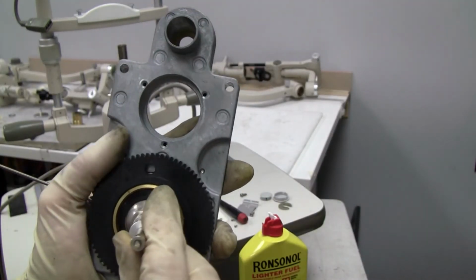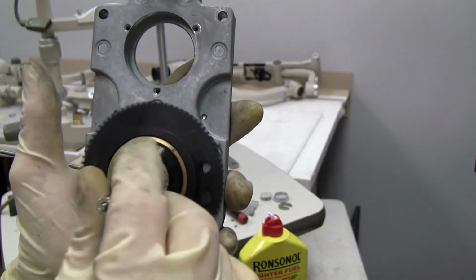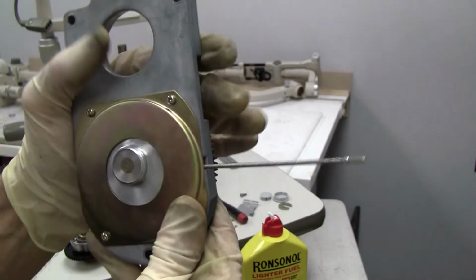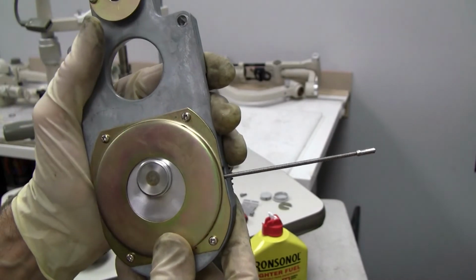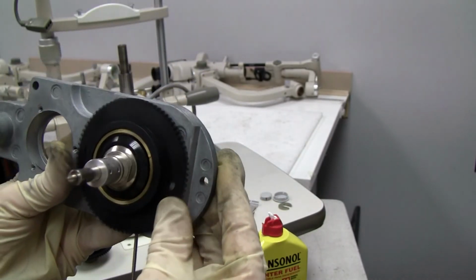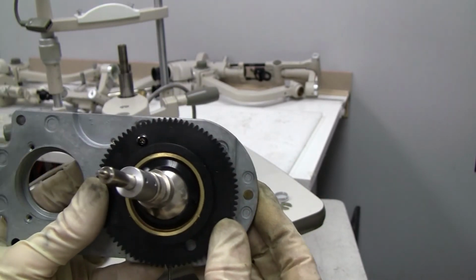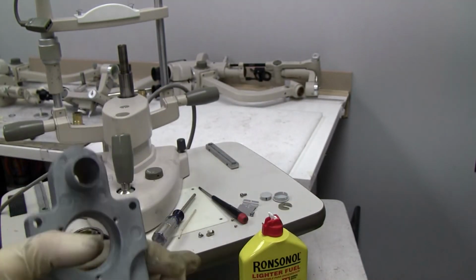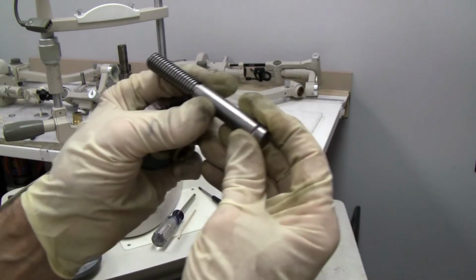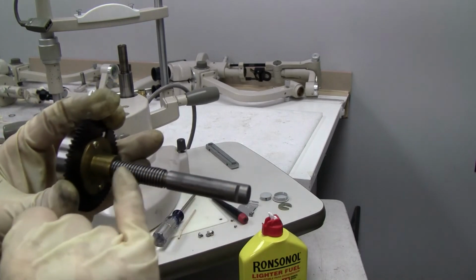And you can check this. Make sure this is free too. And if not, you can also access these by taking your plate off, and then you could access these bearings, there's also three Phillips here. But usually it's not this. Usually it's either these bearings, but this is normally the biggest thing that's making it sluggish, is your grease in here has gotten old.